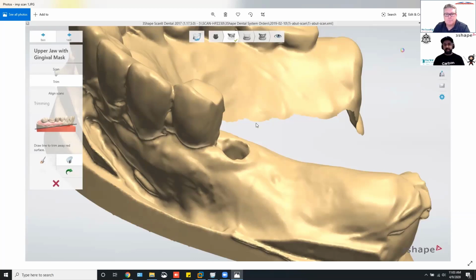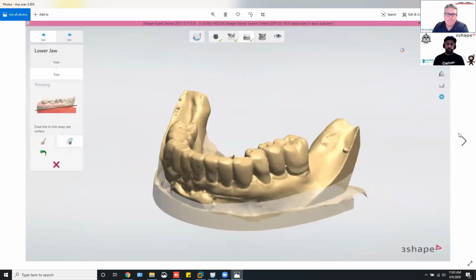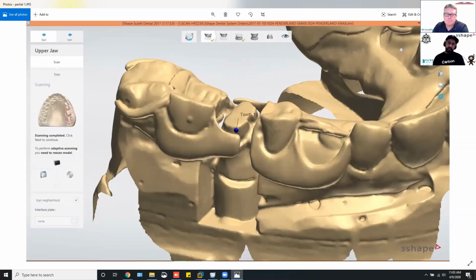When I scan implant models, I scan the first scan with the tissue on there as the tissue scan. Then I take the tissue off and scan the scan body. Then we scan the opposing. This whole time, I already have the next thing mounted, ready to go. Then the bite, and we get a nice clean scan where it shows the tissue's down where it is, and everything else.